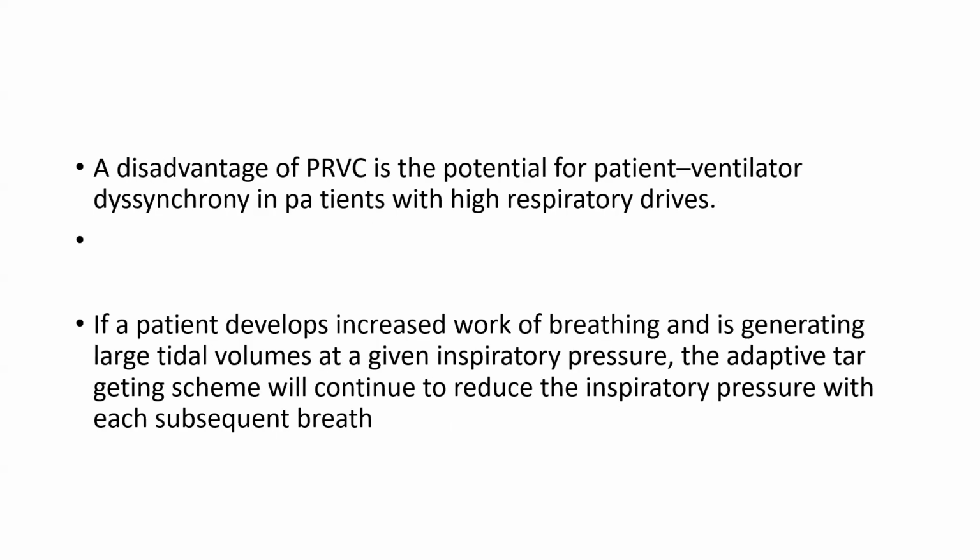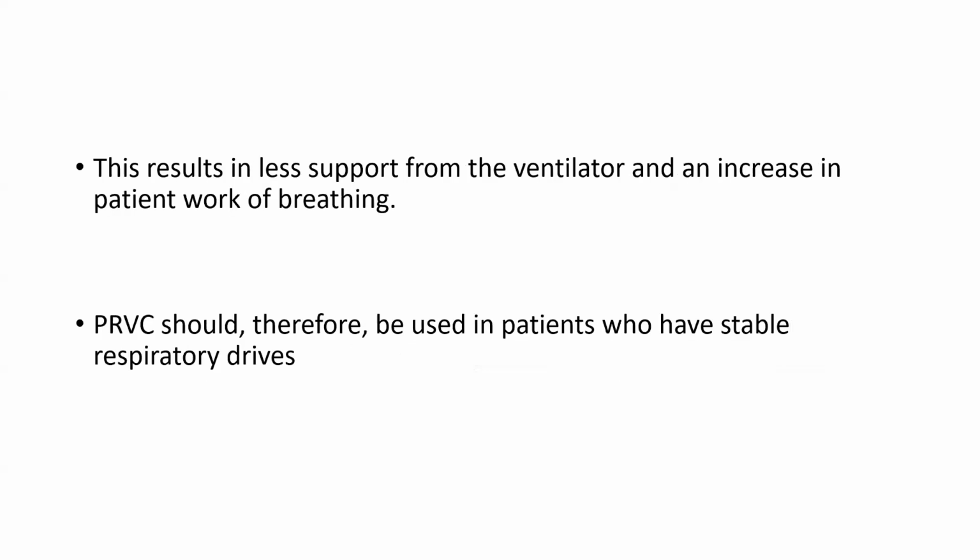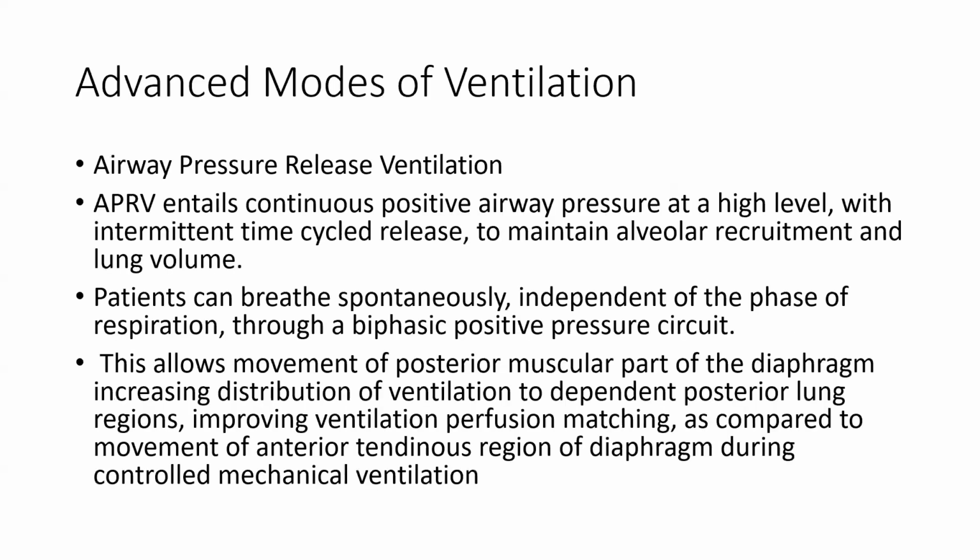The disadvantage of PRVC is the potential for patient-ventilator dyssynchrony in patients with high respiratory drive. If the patient develops increased work of breathing and is generating large tidal volume at a given inspiratory pressure, the adaptive targeting scheme will continue to reduce inspiratory pressure with each subsequent breath. This results in less support from the ventilator and increasing patient work of breathing.